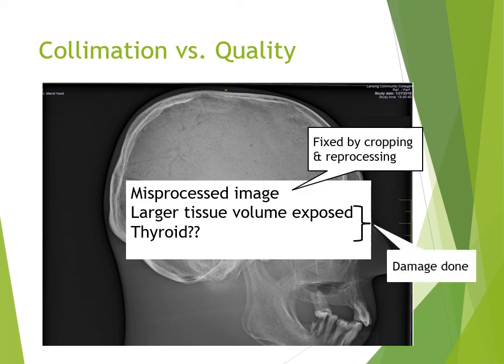As for the unnecessary tissue involvement and the thyroid exposure, it is damage done. It cannot be corrected for this patient. Competent radiographers do make mistakes, but they learn from them and strive not to repeat them.